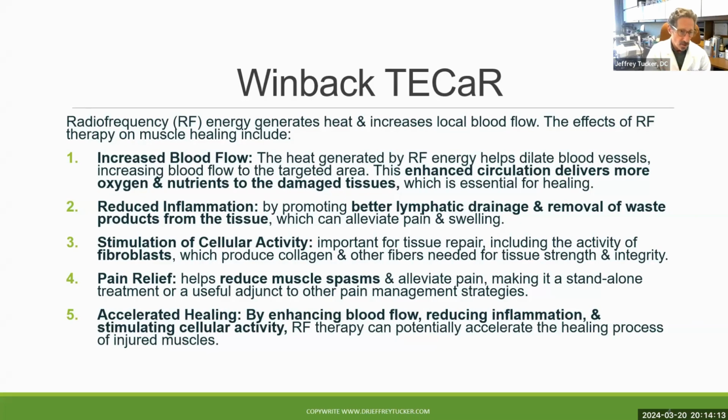We are certainly stimulating cellular activity, i.e. the fibroblast. There is pain relief because we know we're reducing muscle spasms, and we're accelerating healing by increasing blood flow, reducing inflammation, and stimulating cellular activity. So if somebody asked you, what does this therapy do? These are really the 5 bullet points that you might want to share with patients.